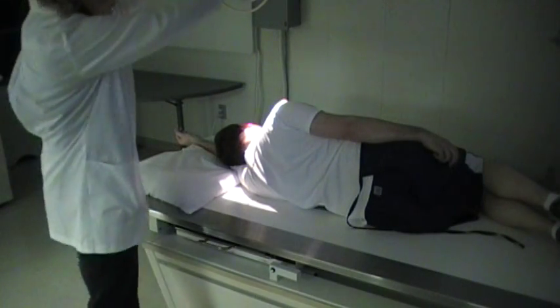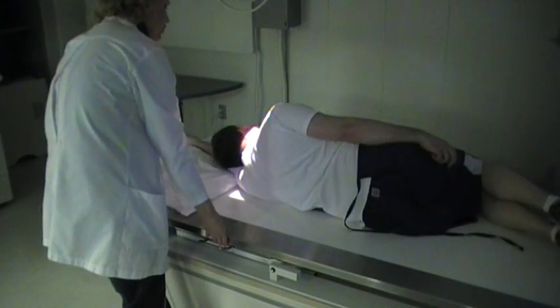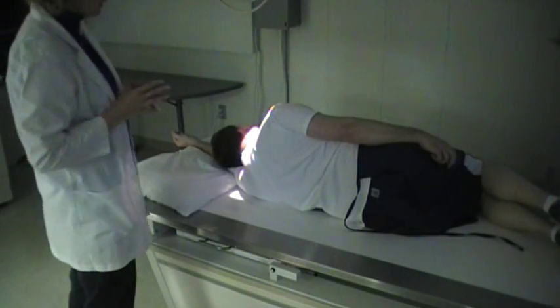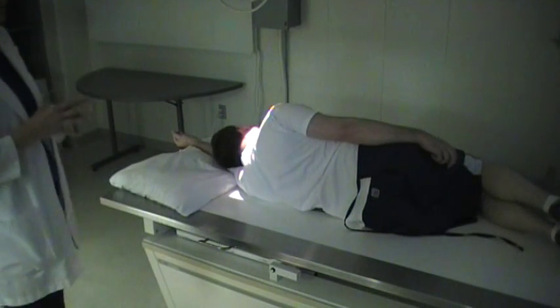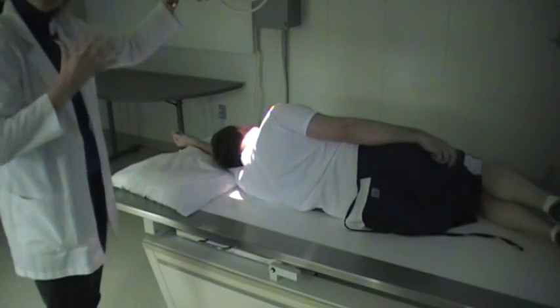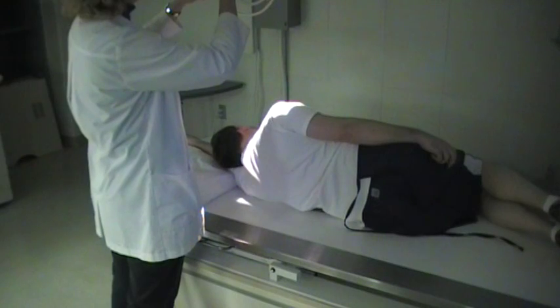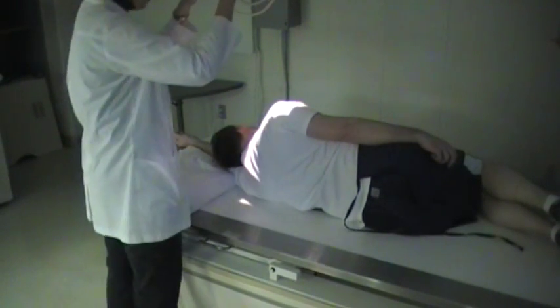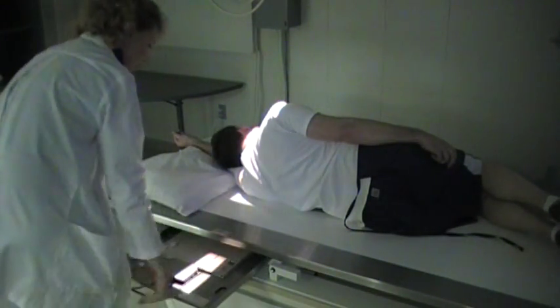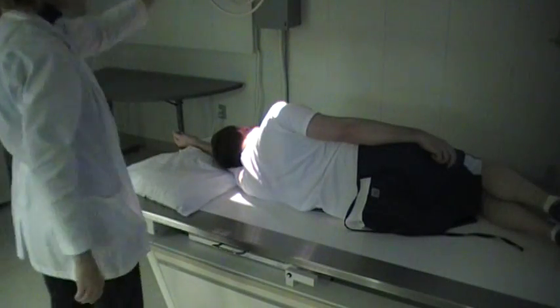Once you have it positioned, collimate down. Move the central ray forward so it's between mid-coronal and a little bit posterior to mid-coronal. With this image, have the patient suspend breathing. If you have difficulty getting the shoulders separated, you can use an angulation of about five degrees caudal to cut through in between the two shoulders. Just remember, if you use angulation, readjust your bucky tray so that it's in line.